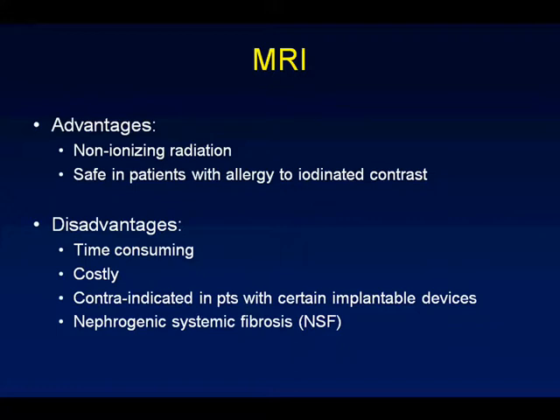Other implantable devices, certainly new ones like neurostimulators and cochlear implants, are all pretty new, and most of them are MRI compatible. We just need to know the make and model to ensure that it is safe. We have a manual that we look up these implantable devices in to determine whether it's safe or not. If it's not in the manual, we need to contact the manufacturer to confirm. But most patients, when they get an implantable device, also get a sticker, a label with a serial number, make and model, and it should tell you on that sticky label whether it's MR compatible or not.